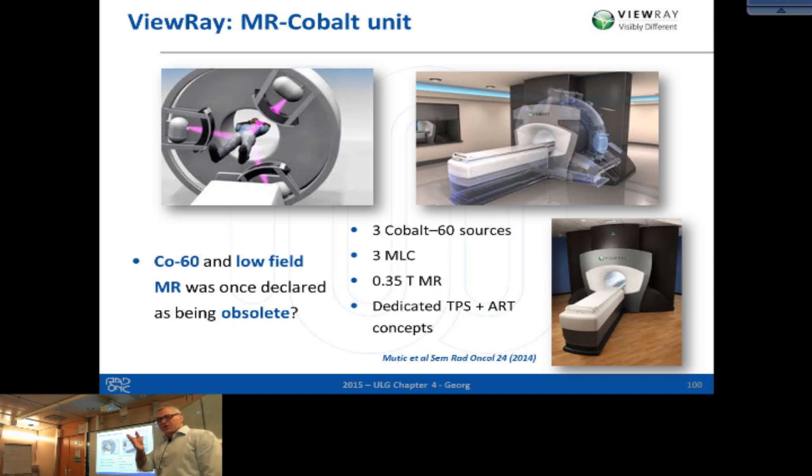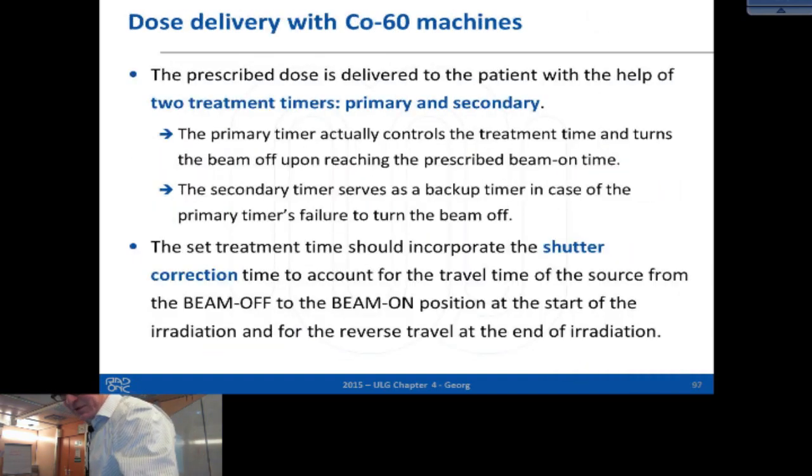And I think you've seen our moving bed. Yeah. So what we are doing is we move the patient while the beam is on. Even with a maximum collimator opening, you cannot reach the whole body. And for example, a colleague of mine, they have a department in Jena, and they put the cobalt source. I mean, it was a very interesting thing.